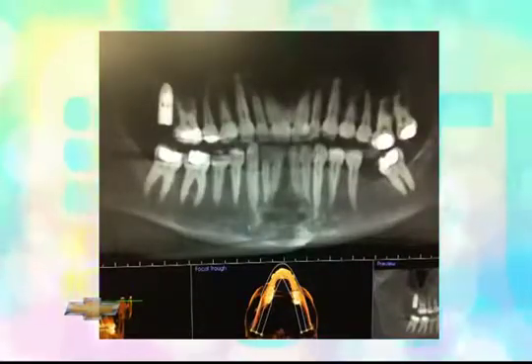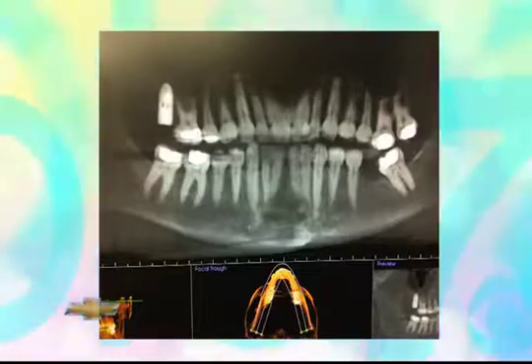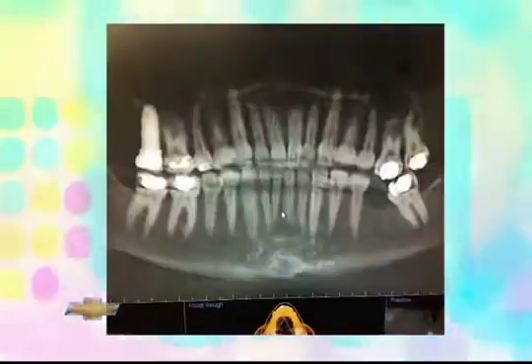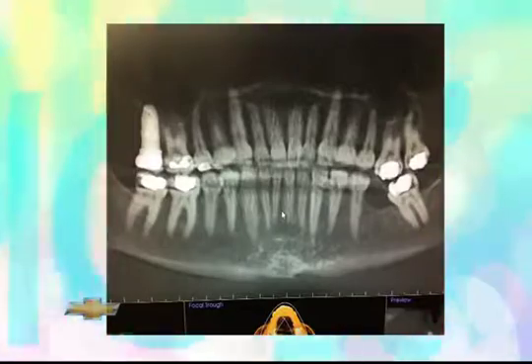So we're going to start with, you have some x-rays that you want to kind of teach us a little bit about this. So tell me what we're seeing right here. This is a panoramic x-ray, it's called, of a patient of mine. This is just a picture showing the implant in place to replace that back tooth on the upper left. Now the next x-ray shows with the crown on it. And so when you have the crown then put on the implant, you have your tooth replaced.